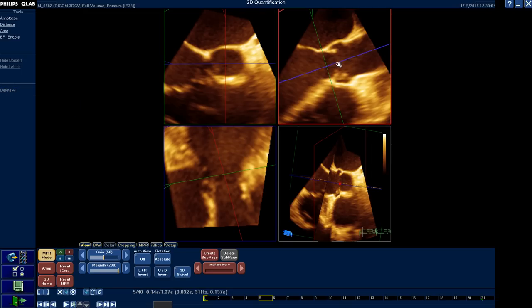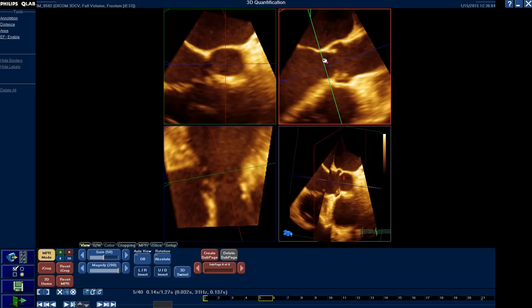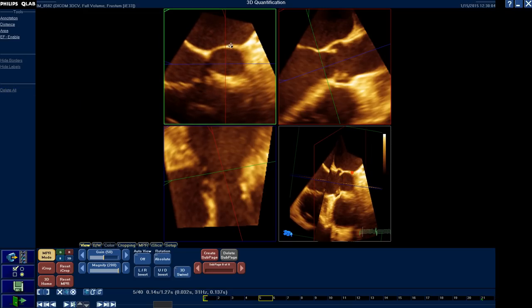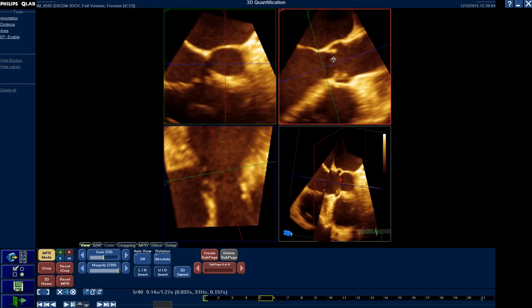Delete all. If I move down a little bit, this is the LVOT. I can also trace this to get the area, and I can use this area during calculation of the stroke volume in the continuity equation, and so on.